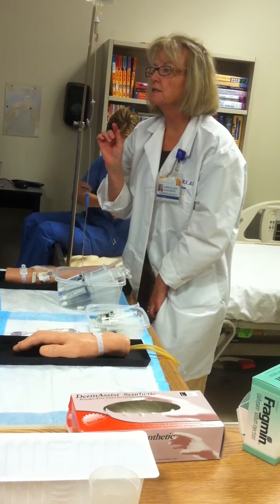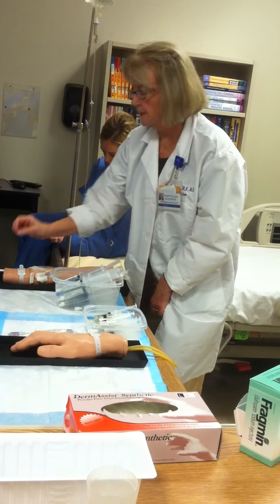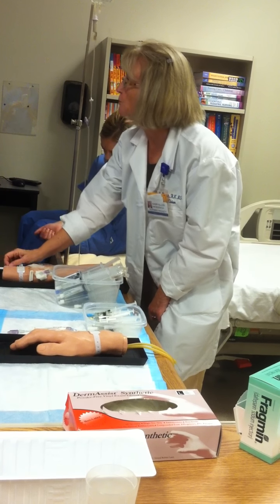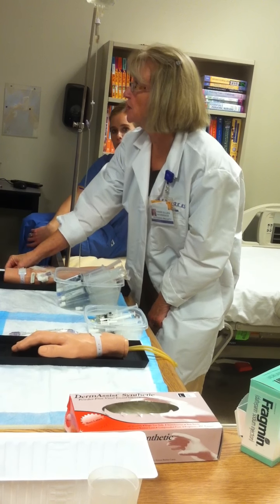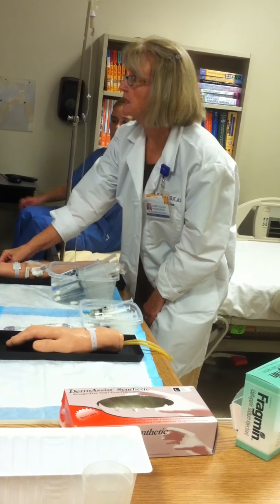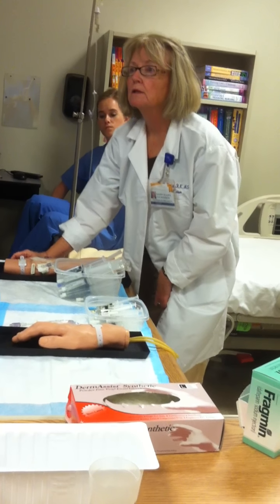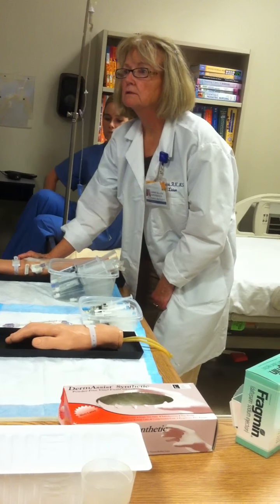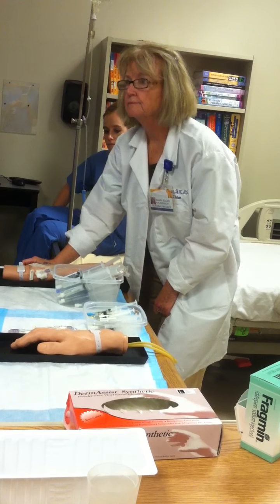One thing is, even if the patient doesn't have an allergy bracelet on, double-check if they have an allergy. Scan the patient's barcode on the ID band if required.